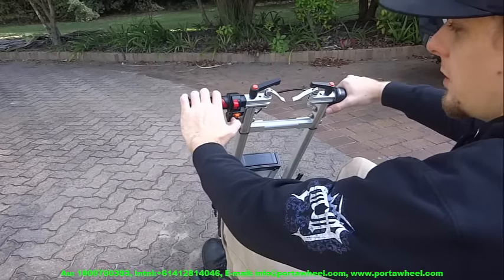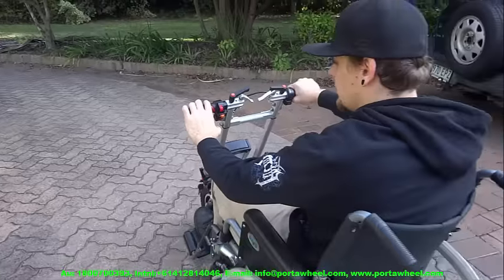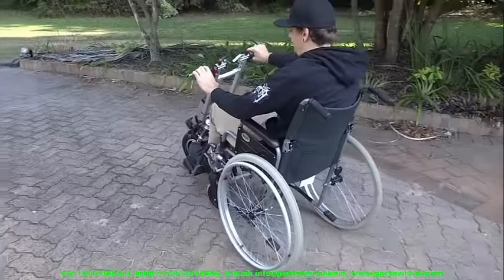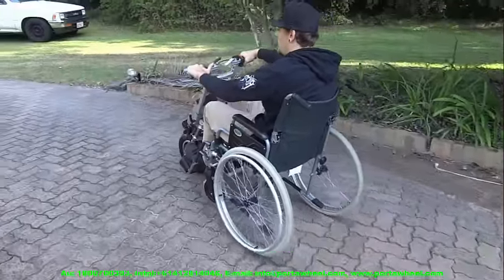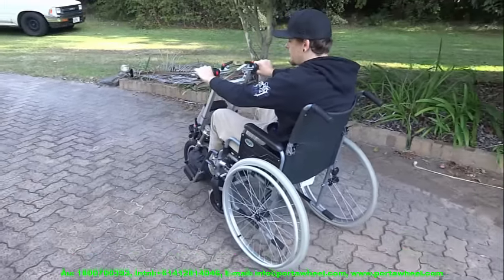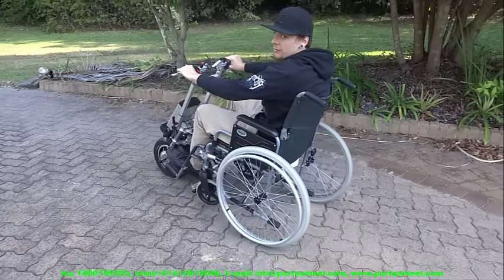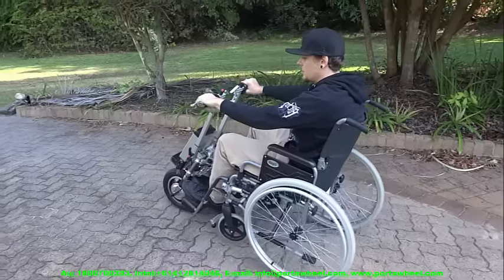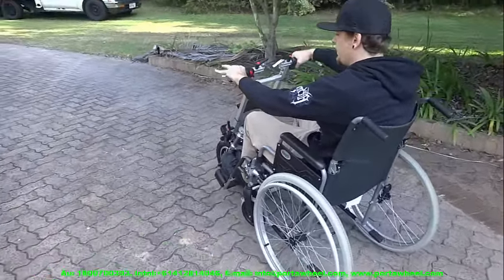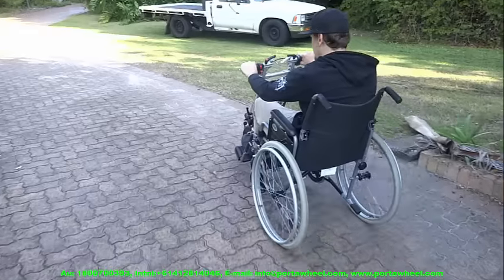Next we're going outside to demonstrate the 6 different speed settings. There are 2 models: the PortaWheel 380 with a range of 38km per charge and a top speed of about 25km/h, and the PortaWheel 680 Turbo — the model demonstrated here — with a range of 40 to 50km depending on terrain and a top speed of approximately 38km/h. We start at the slowest speed, which is a complete crawl, perfect for indoor use, crowded areas, or those with limited dexterity.